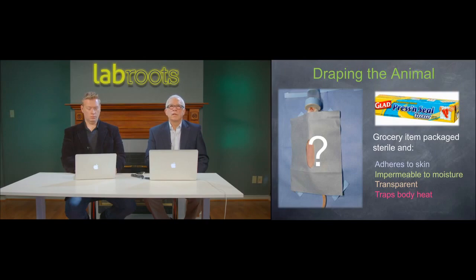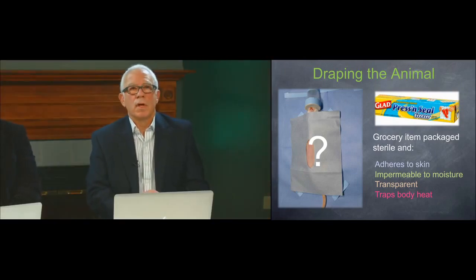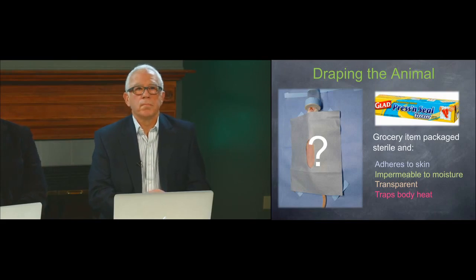So we go in favor of press and seal, not only as a drape for the animal, which you've already seen, but also for the table to extend your sterile field, and other items which we will show you in a few minutes.